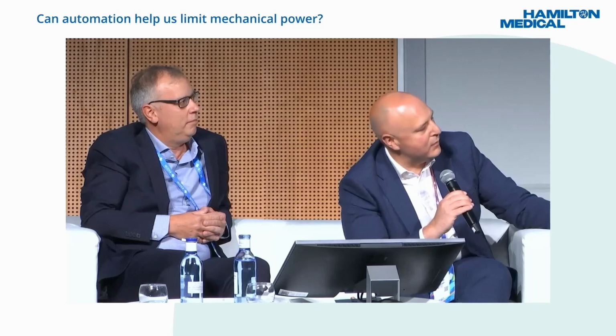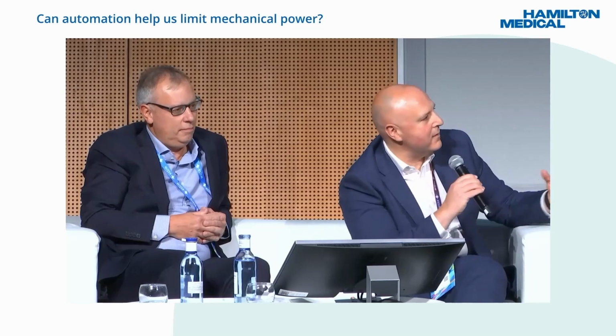Now, there are two quick questions. One is to say how small the patients have to be tested with IntelliVent or to use IntelliVent. Is there a size? You can go down to, I think, 15 or 20 kilograms. 10. Okay, I have somebody to help me. 10 kilograms. So we should be okay.